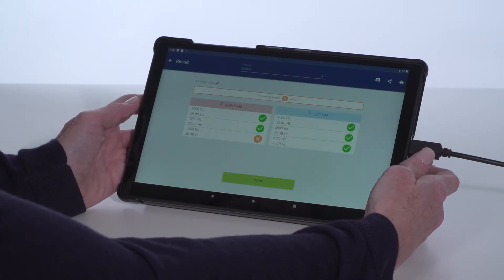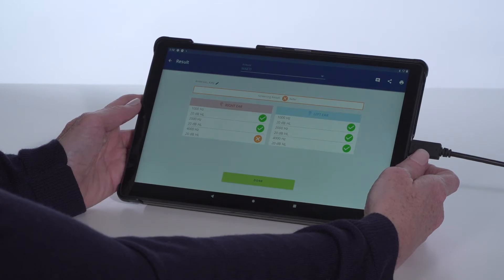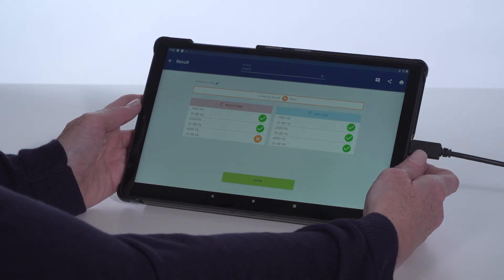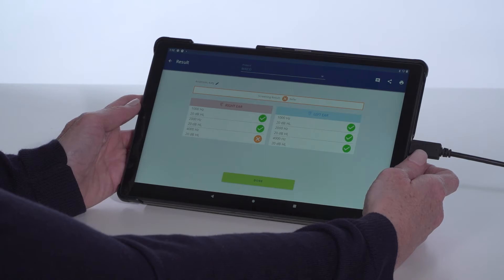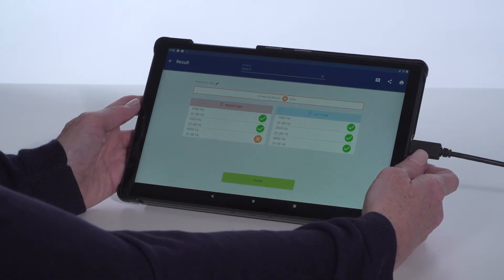At the end of the test, the device will transition to the results screen with an overall pass or refer result, as well as the individual frequency results.